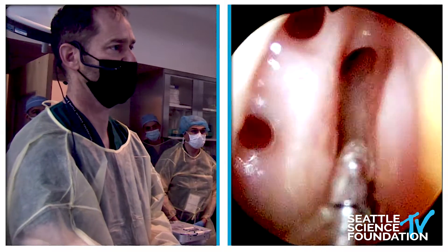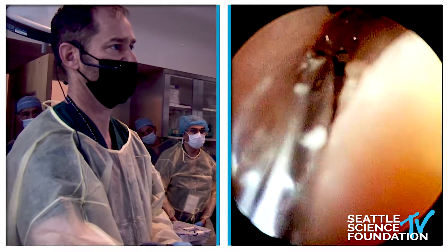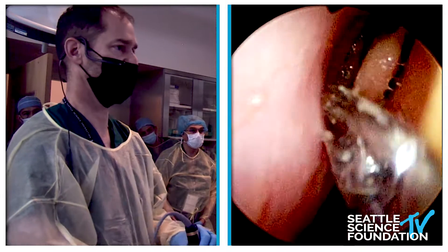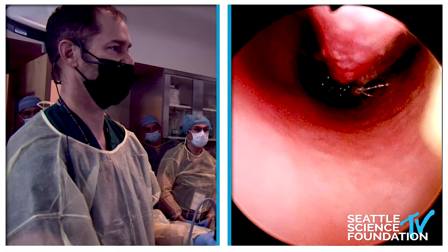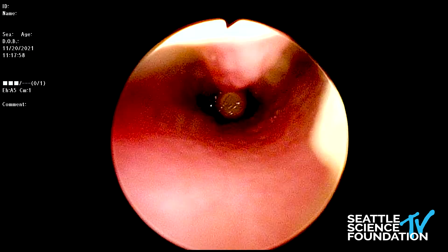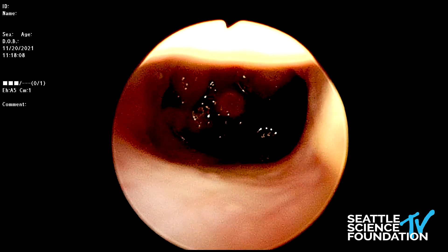As long as you don't go through the middle turbinate, you're going to be safe. So now you can see we're posterior — then we get to come anterior. This is a good opportunity to talk about whether your navigation is working right. There are key landmarks that don't change: touch the floor of the nose — if the nav shows you're in the mouth and you can see you're on the floor of the nose, you know you're off. The nasopharynx also doesn't move very much. Anterior-posterior, I look pretty good there on the sagittal.